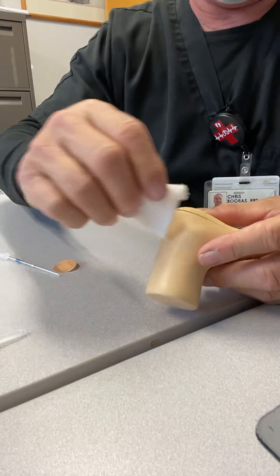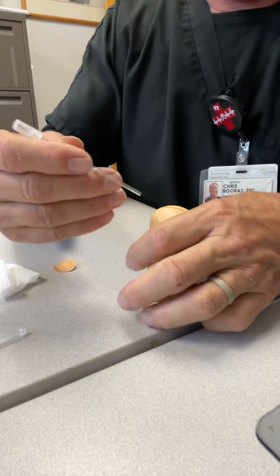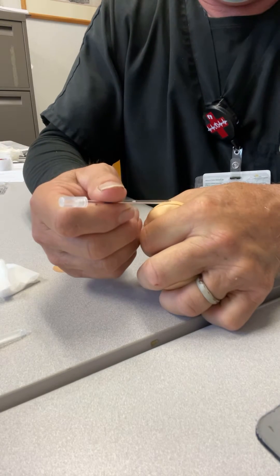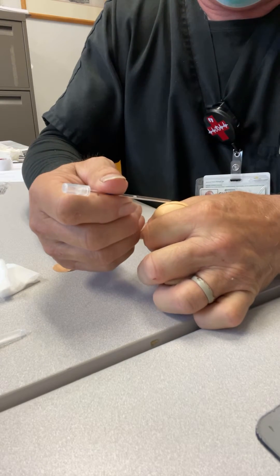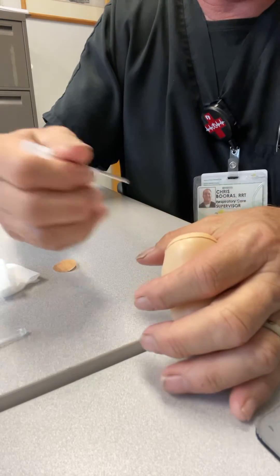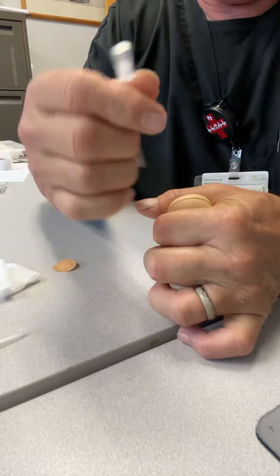Once that baby gets stuck, you'll wipe it one time when the blood starts coming out. Then you start the milking process — it's like grabbing a big old pimple. Squeeze it up and get your blood. Let it relax and fill back up, capillary refill. Move it to the top and let it go up again; squeeze it to the top and it'll come out.